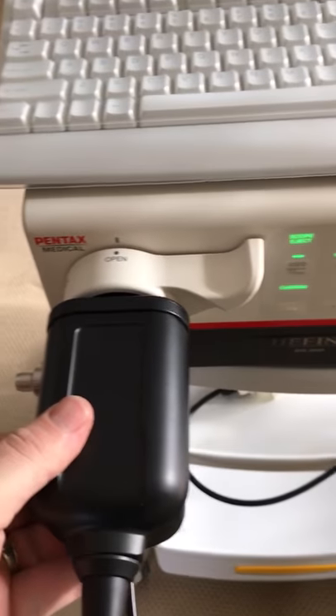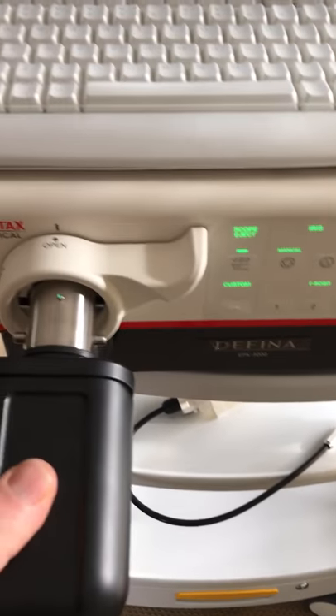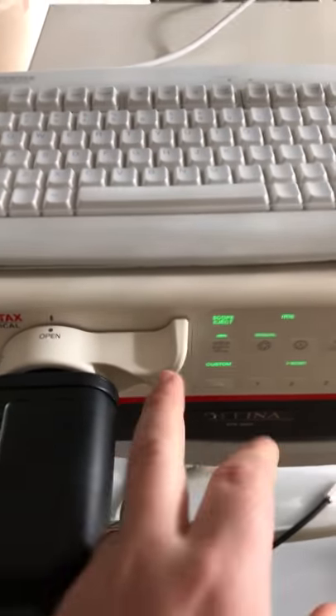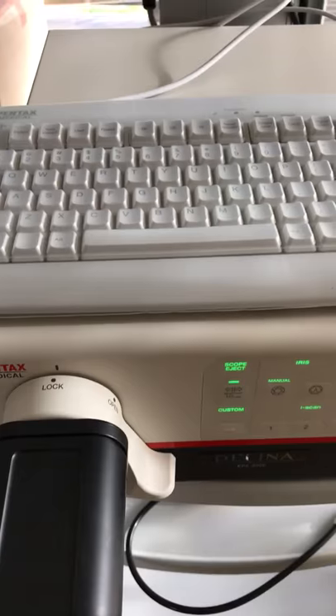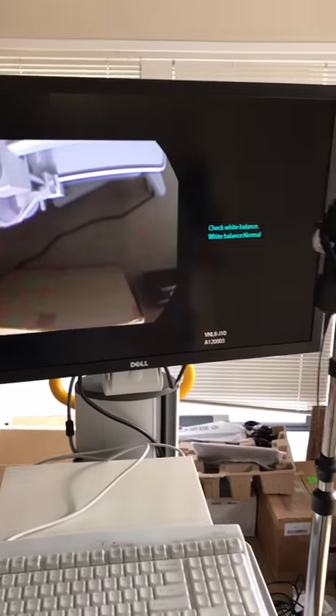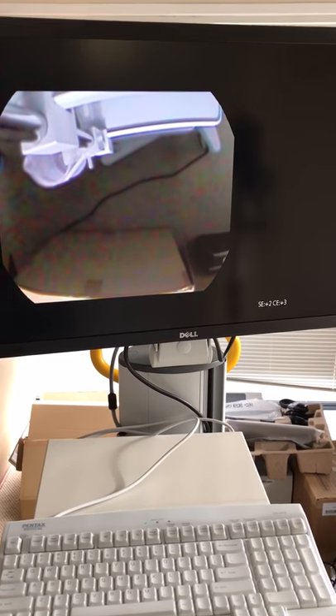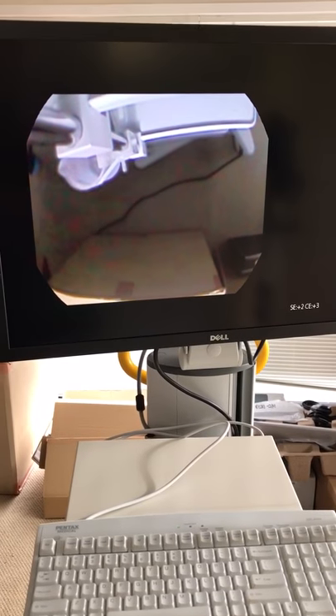I'll turn this video on here. I'm going to plug it in — green onto green — plug it in, click. Now we should be connected, waiting for the scope.